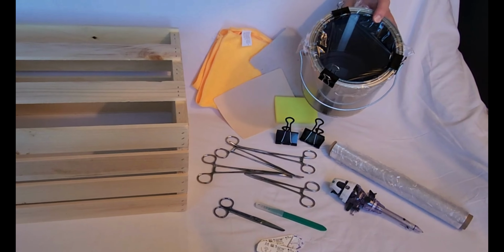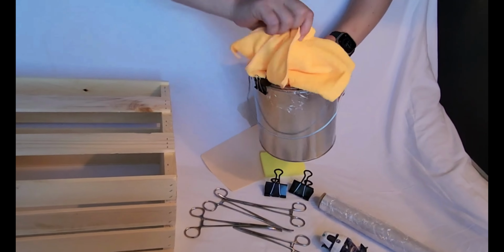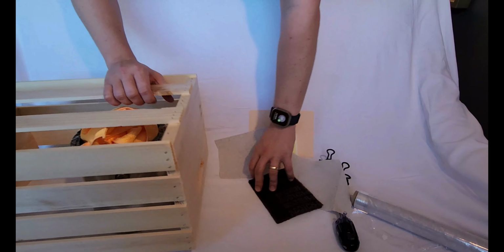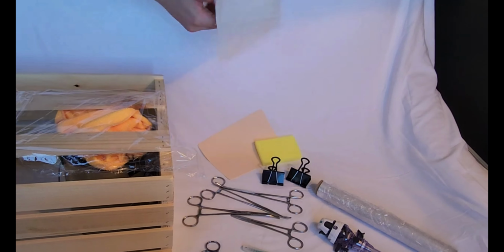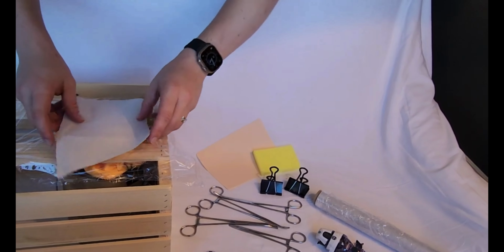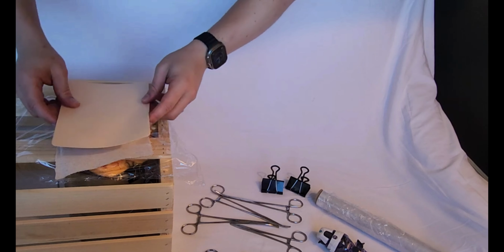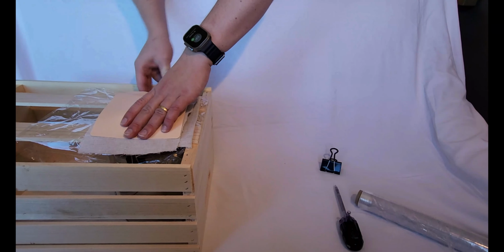We will begin building our simulation by attaching the plastic wrap to the top of the paint can with clips. Next, we will place the microfiber cloth on top of the paint can. So we will place plastic wrap as peritoneum, a layer of canvas to represent fascia, a sponge for subcutaneous tissue, and tattoo skin. We'll use clips to hold the layers in place.